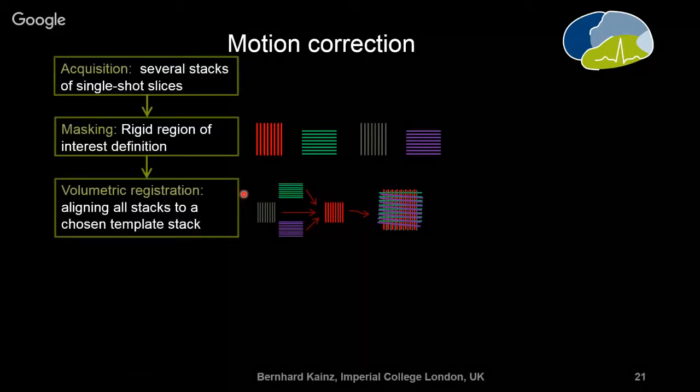Our general pipeline is actually quite simple. These kinds of approaches are all called slice to volume registration approaches. You can use them for various kinds of motion compensation if you have exactly this kind of problem. But what we do, in fact, is, well, first of all, I'll come back to this later. First of all, we need to select a specific region like the brain. With this approach, we can currently only reconstruct for one bulk of motion. Something like the brain and the head is a rigidly enclosed compartment, and the fetus moves it at once.